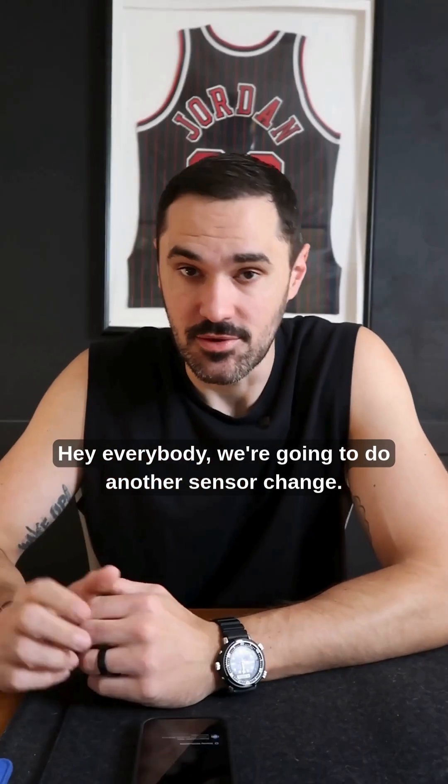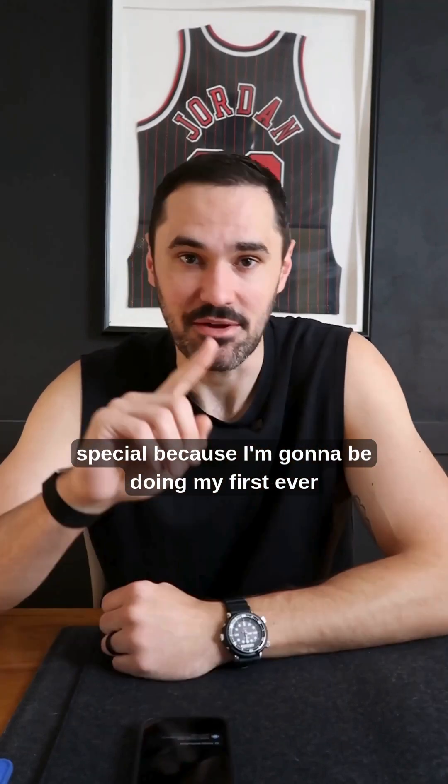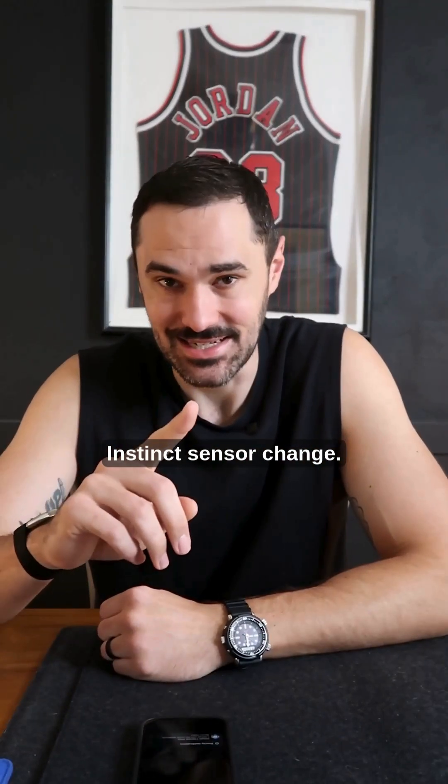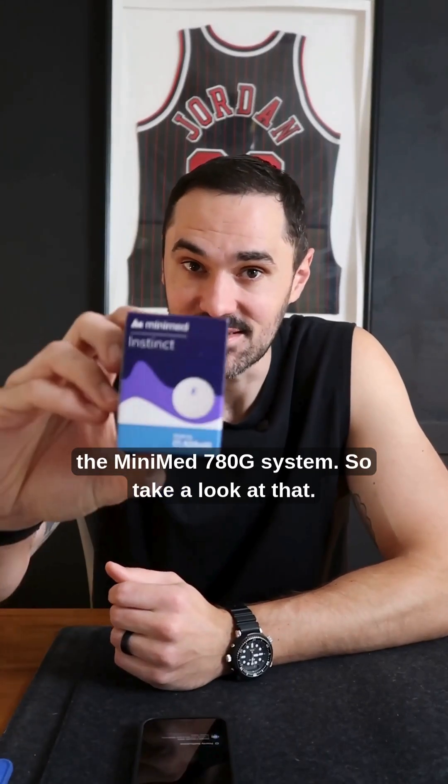Hey everybody, we're going to do another sensor change. But today is special because I'm going to be doing my first ever instinct sensor change. The instinct sensor is made by Abbott specifically for the MiniMed 780G system.